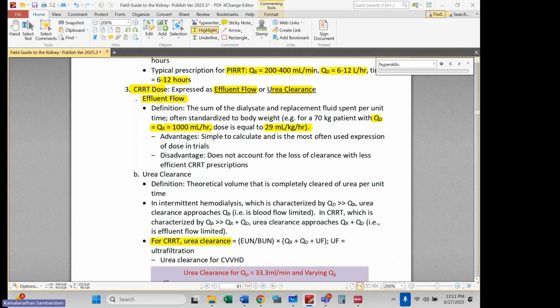Okay, well, let's recalculate that in terms of total effluent flow in milliliters per kilogram per hour. That's just too much math, especially if you're pulling this stuff into your notes. You have to recalculate the effluent flow rates. I just say you went from 2 liters an hour to 2.5 liters an hour, right? No math required, or simple math, just addition, okay?